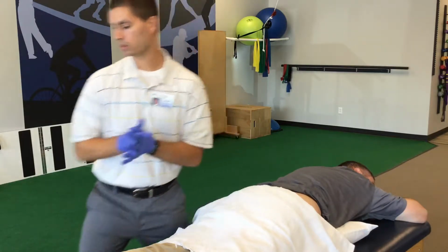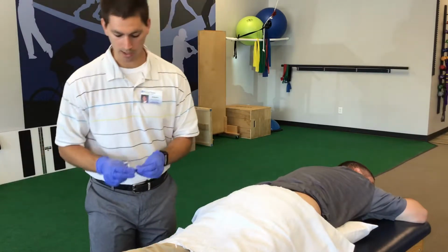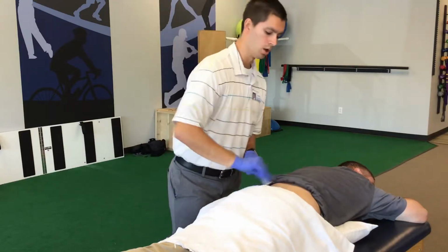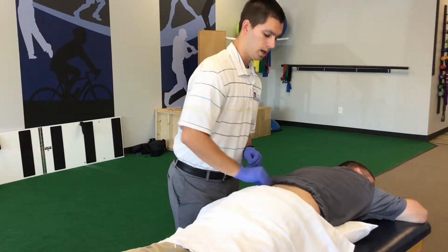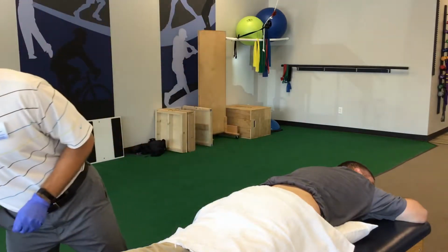And so what we do is, assuming that everything looked good, and I've talked with Josh, and I know what's going on, where he's having more peripheral type pain, so it's not necessarily along the spine. He's not having any pain shooting or radiating down into his legs, and it's more muscular in nature. So what we're going to do is we're going to needle the L4 and L5 spinous process.